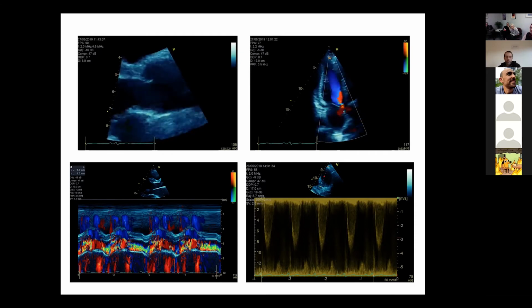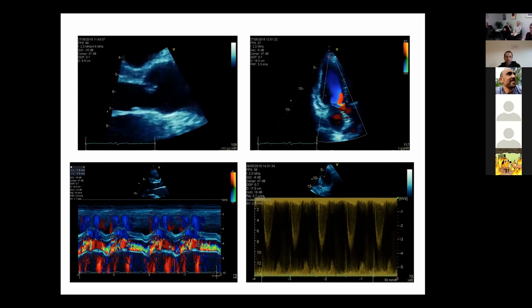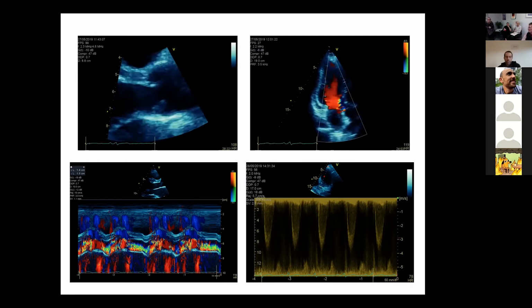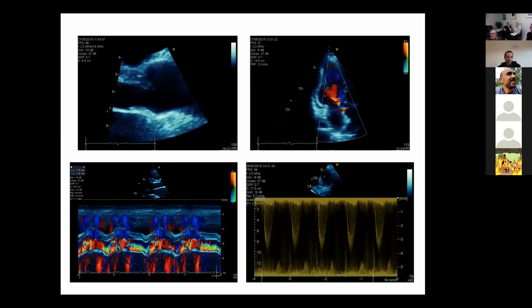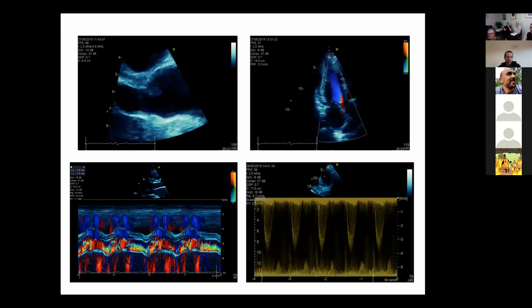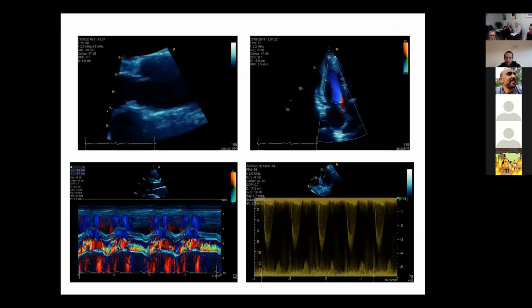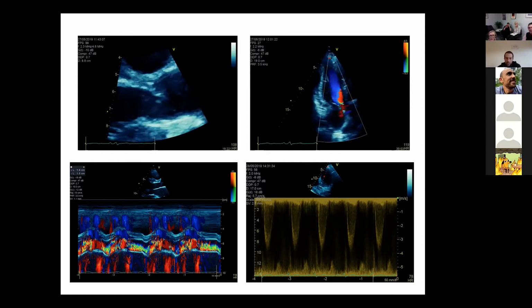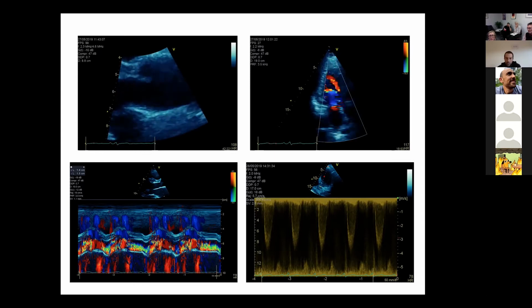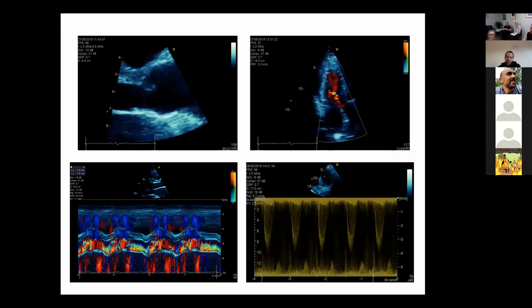Can I ask Emma to critically analyse the bottom right image, please? I think that'd be great. You have, so that there's aliasing of the signal. Very nice. And there are multiple ghosting gates that you can see there. Very nice. So that signal could be from not the one that you're thinking it is, it could be from the ones further up. Very nice. So you need to optimise it. And so how would you get rid of the gates?